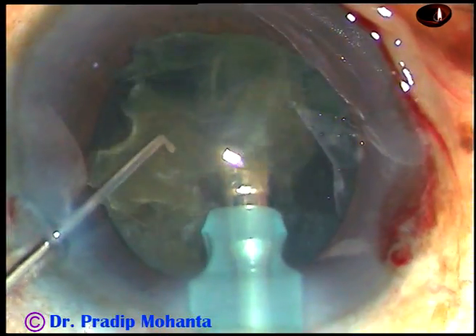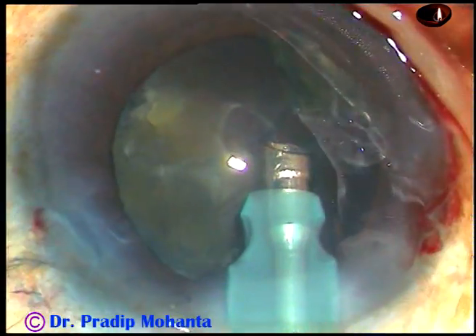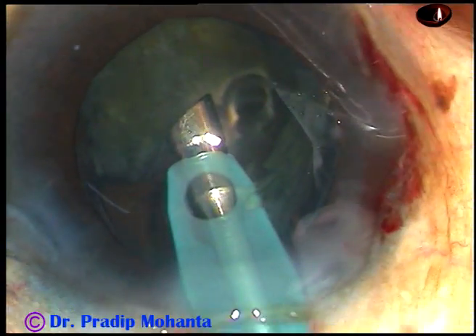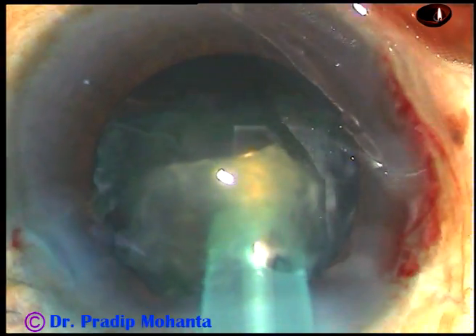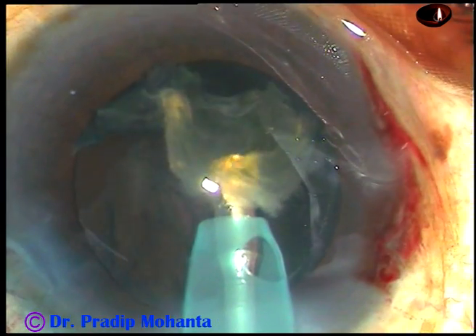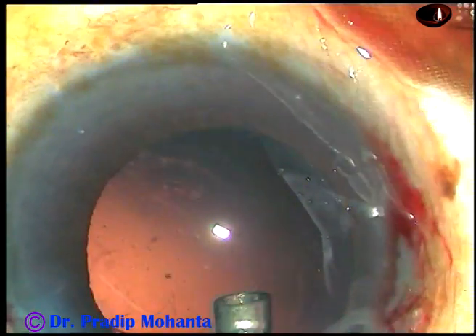And now, this is the last portion of the nucleus. It tilts very easily because there is a lot of room in the anterior chamber now. The chopper is removed so that the anterior chamber stability is much more. And this last portion of the nucleus comes out.